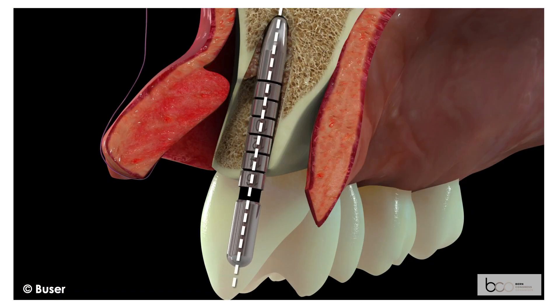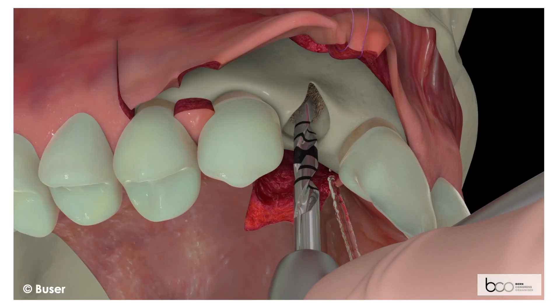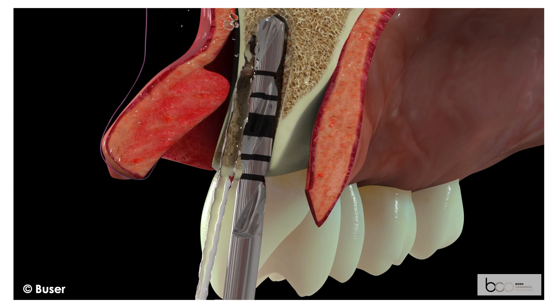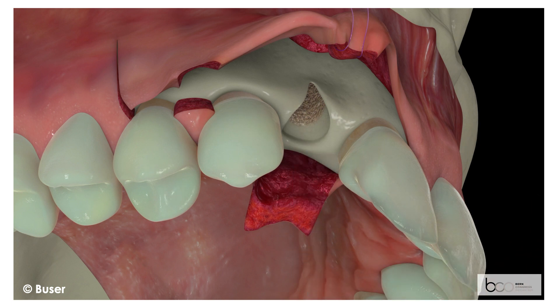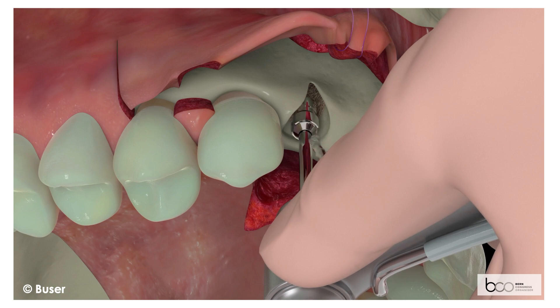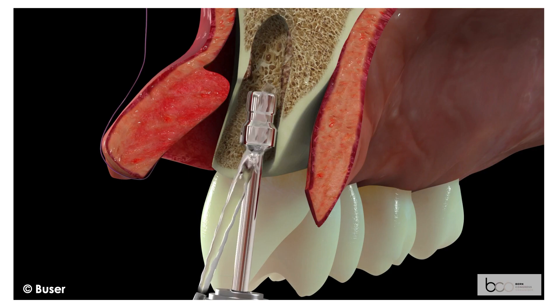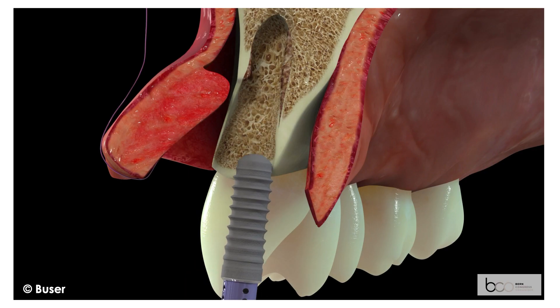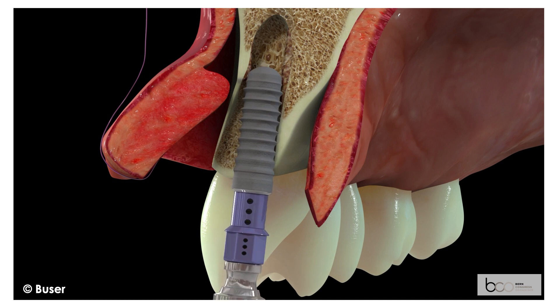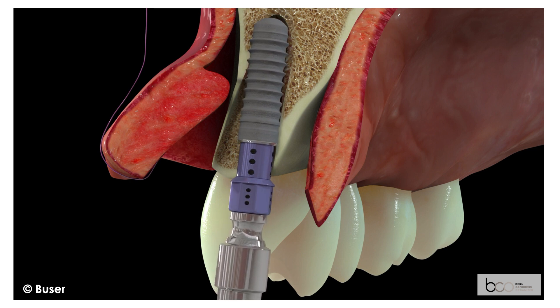The axis must be carefully corrected to a slightly more inclined axis. This is done with the second spiral drill using a reduced drilling speed of 500 rpm, with a preparation depth chosen at 14 mm. The second depth gauge confirms the correct implant axis. The final preparation is done with a profile drill, removing spongious bone at the inner surface of the palatal bone wall. The implant is inserted at a speed of 15 rpm without irrigation, with the implant shoulder always located sub-crestally in relation to the palatal wall.